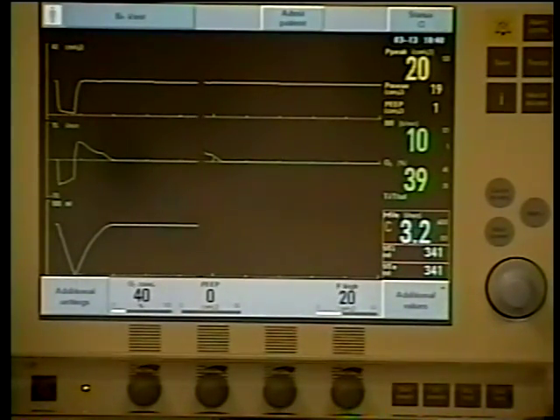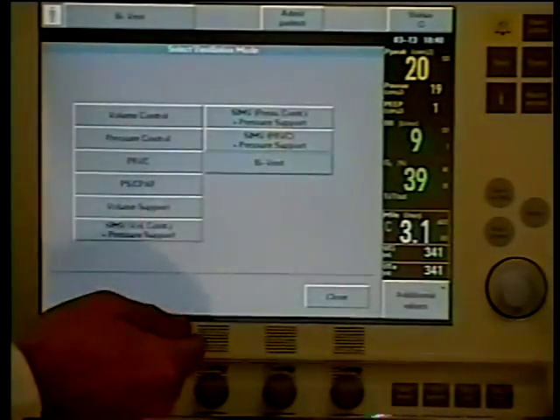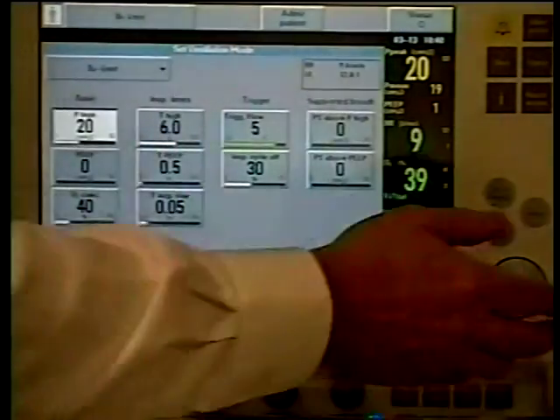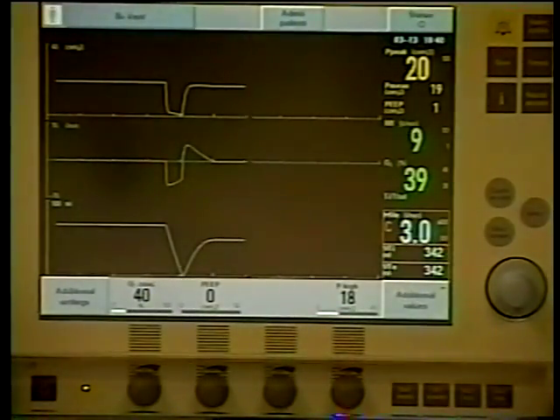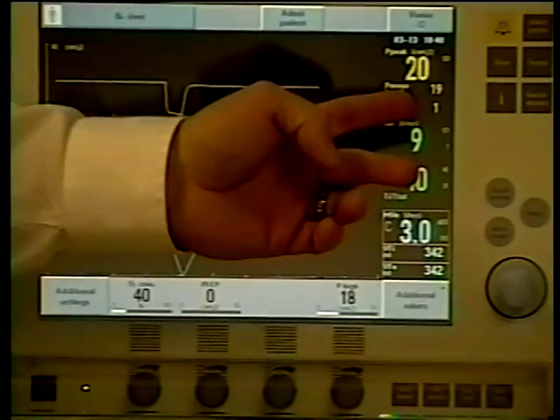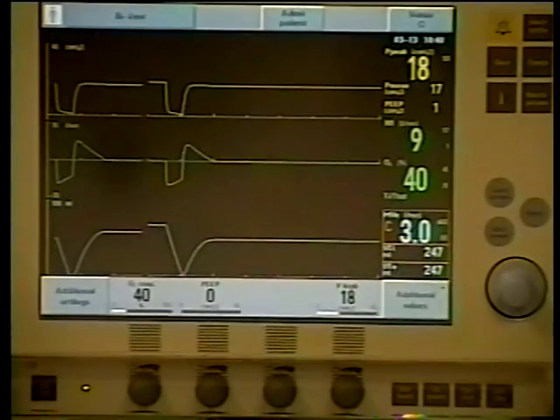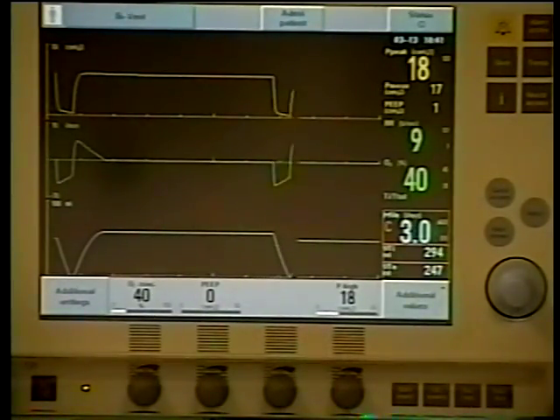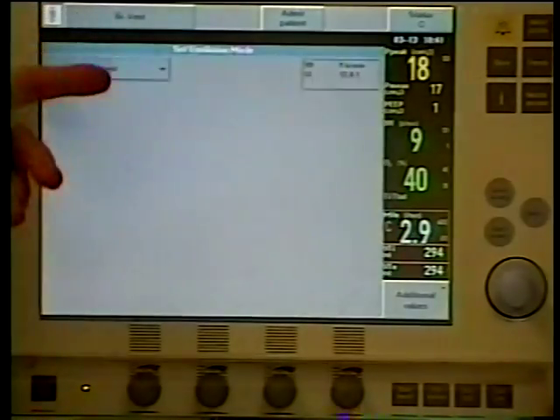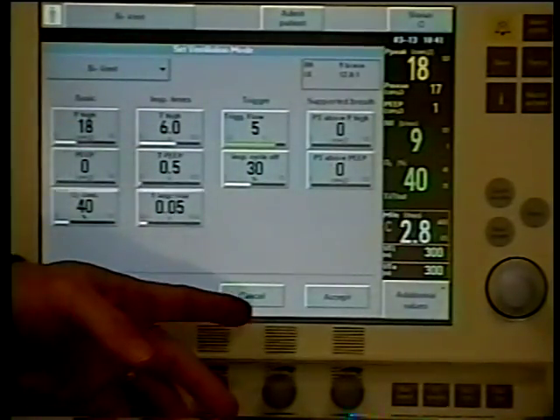Because you can kind of match up some mean airway pressure in the teens, and you know that may necessitate you get this P high down into somewhere between the 15 and 20 centimeter range, just so that your mean starts to drop down. But you really want to have that mean at a value that you can at least somewhat mimic in conventional, so it's not such a big drop off the cliff whenever you go into conventional ventilation. But that's the drop and stretch method, just dropping that P high down, stretching that T high out.